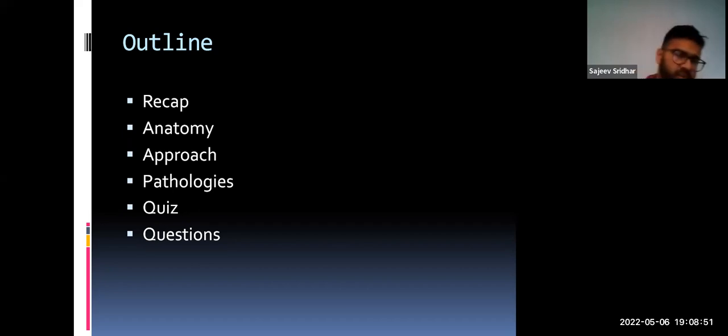A conventional approach, I'm not going to go into too much in terms of the approach itself. The reason why is because this lecture is mainly focused on medical students, especially ones who are about to become F1s, F2s, something like that. If I were to go into a lot more detail, then it would just be confusing.